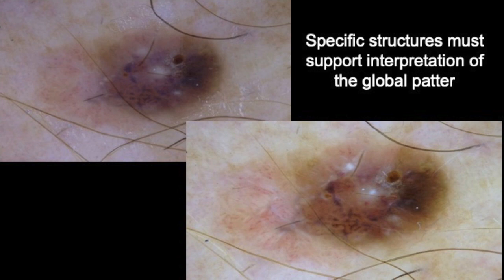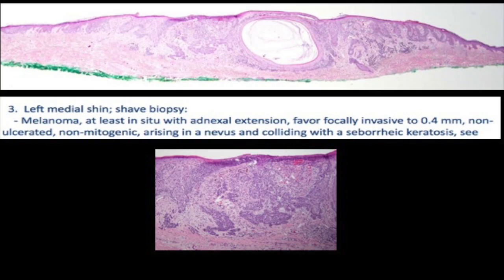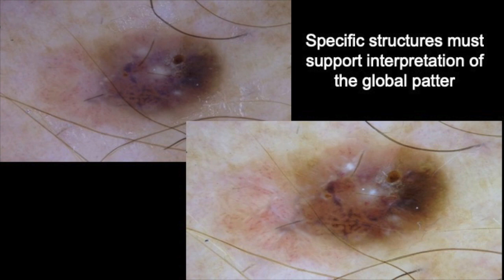So they're regression structures. And what about here? They're dotted vessels. Dotted vessels is not a vessel of seb. What is? Hairpin. These are not hairpin. You got dotted vessels, you got regression structures, and yes, there are milia cysts and a comedo, but I cannot know for sure. This would be a lesion I would biopsy, right? In this case, to no surprise, it came back as a collision between a seborrheic keratosis and a melanoma. So again, you cannot anchor your diagnosis on any specific structure. You have to look at all 4 quadrants, and all 4 quadrants have to have the structures that are consistent with the diagnosis that you're making. That is the point of this lesion: yes, this quadrant is consistent with a seborrheic keratosis, but this quadrant is not consistent with a seborrheic keratosis at all, and so it would require a biopsy.